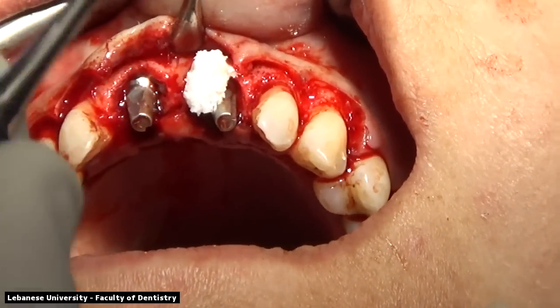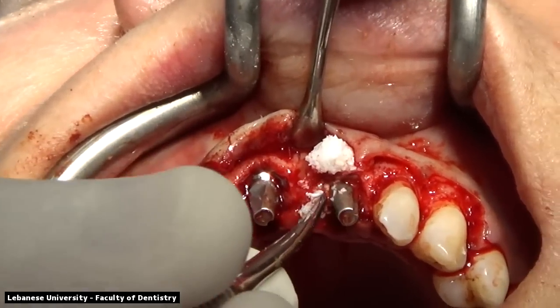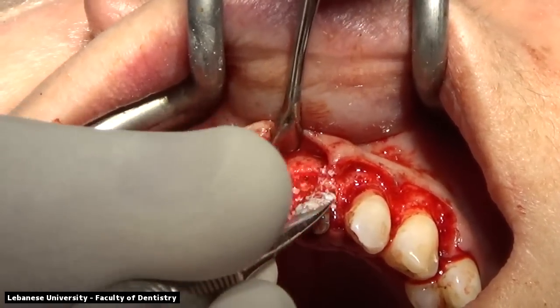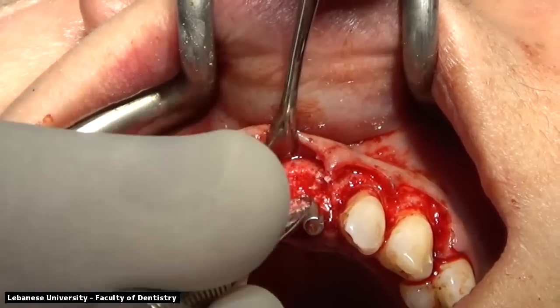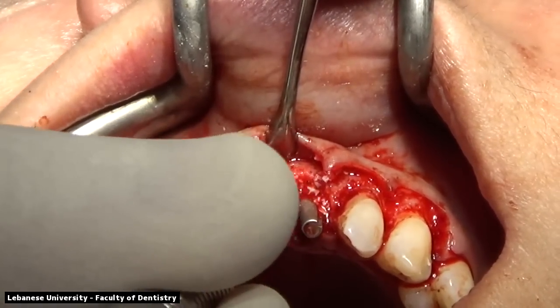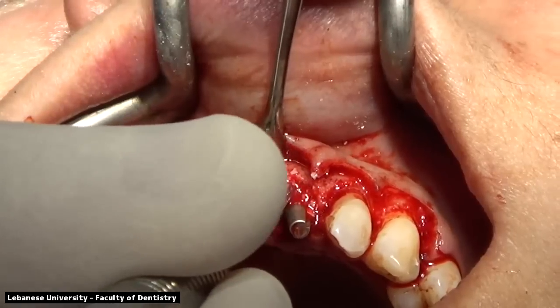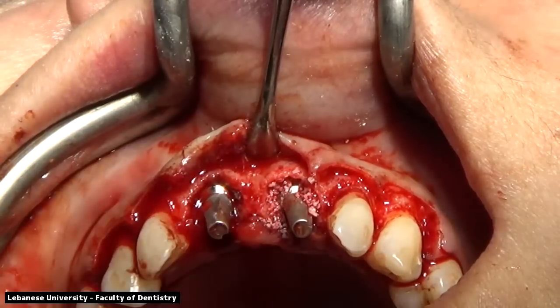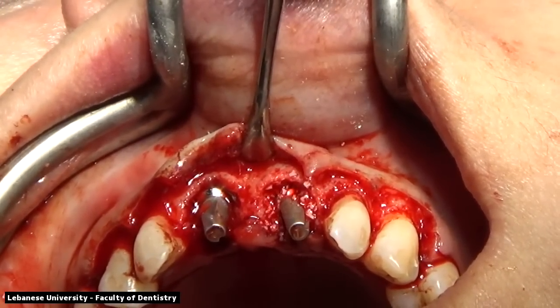Adding the particulate bone graft, which is a xenograft material, Bio-Oss. It's bovine in origin, small particles. We're packing it in the gap between the implant and the buccal plate of bone. You can appreciate that there is some bleeding, which will be dried off very carefully with the suction or with the tip of the gauze itself.